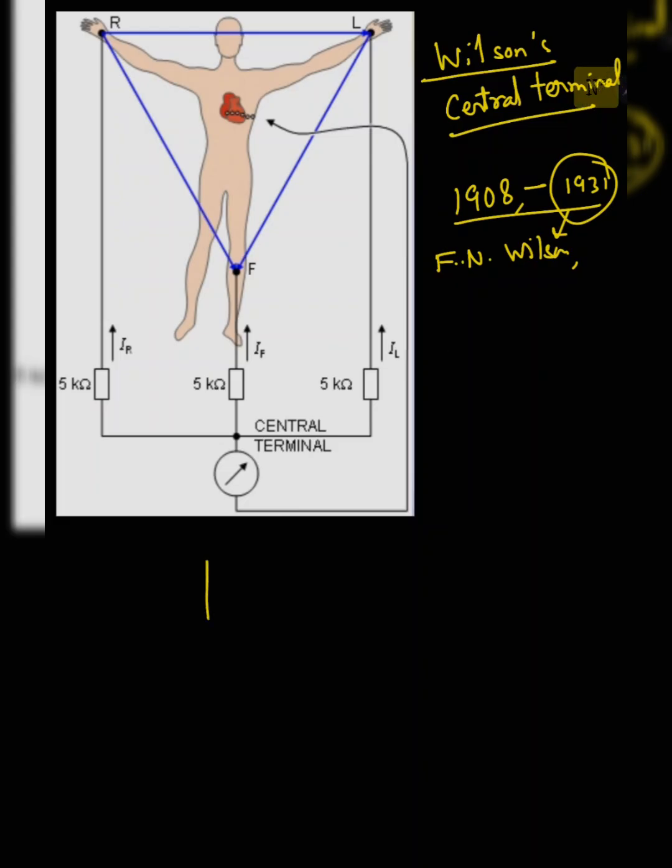in a regular ECG machine, there was an electrode, a galvanometer, having a positive terminal and a negative terminal, and we know there are three different electrodes: standard limb electrodes, then augmented electrodes, and the chest electrodes.